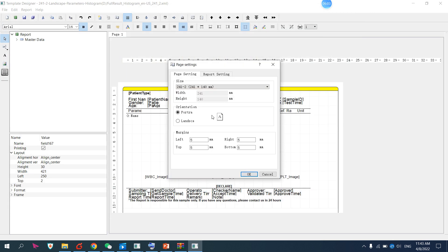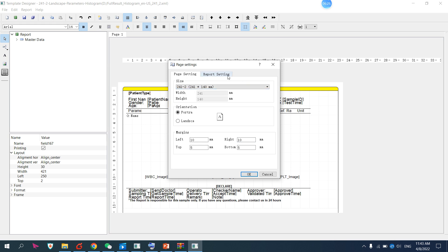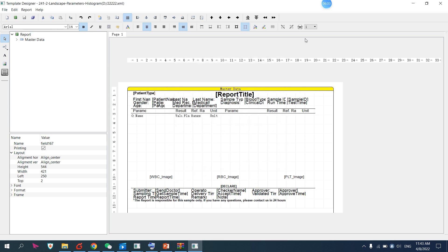There is also another option: you can adjust the page settings. For the left side, you can increase from 5mm to 10mm. From the right, you can also set 10mm. Top and bottom margins — set whatever you want. You can also adjust the page size and report settings. Edit everything according to your requirement, then save.